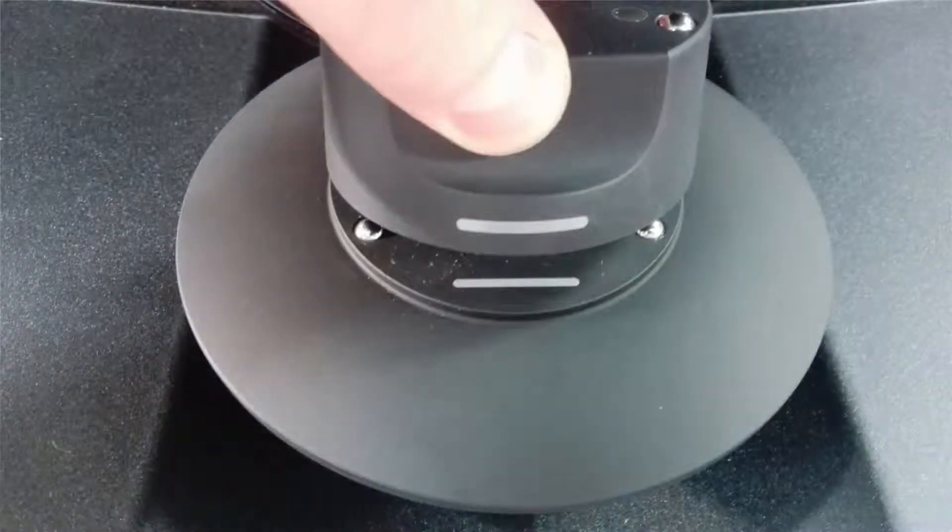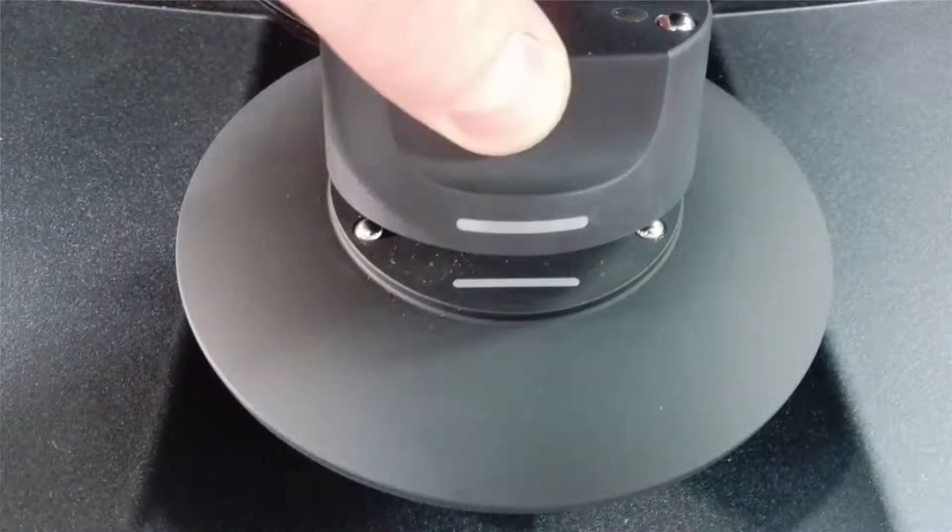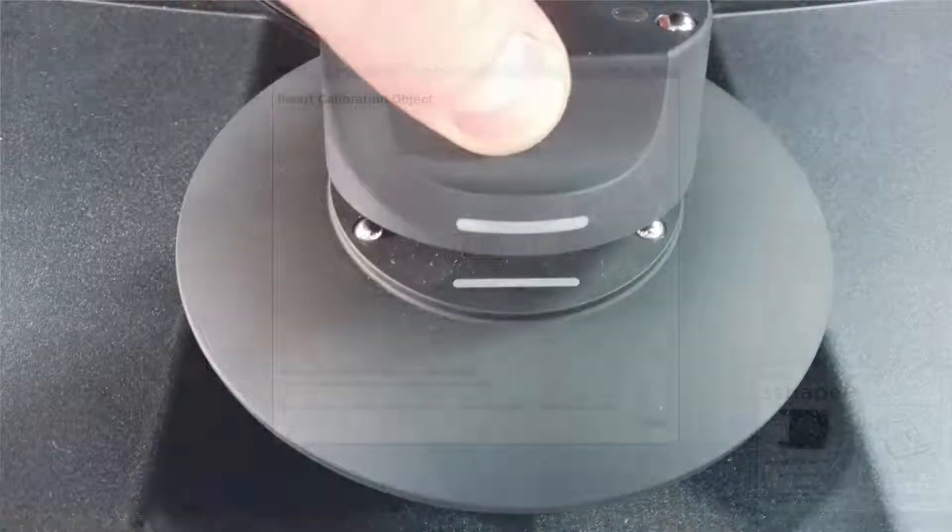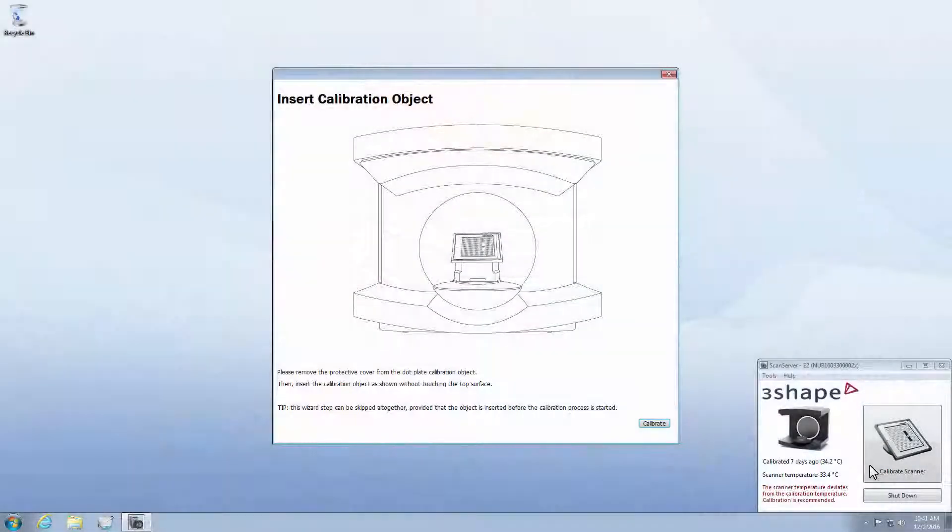Be aware that the ScanHeight adapter must always be rotated so that the two white lines match up. It is particularly important during the calibration process.